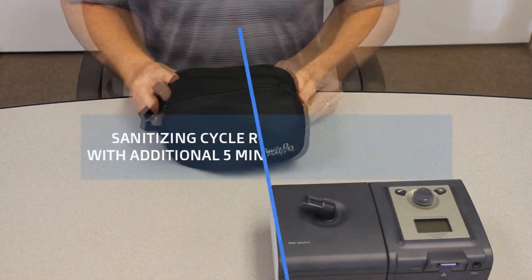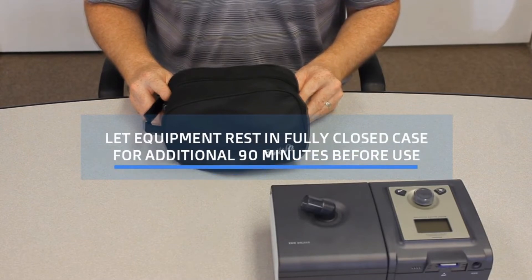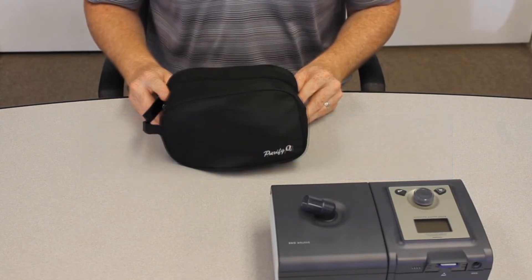The unit will run for 35 minutes — 30 minutes generating ozone with the fan blowing the ambient air for an additional five minutes. We then recommend 90 minutes to 120 minutes, or two hours, prior to opening the bag and using your CPAP equipment.